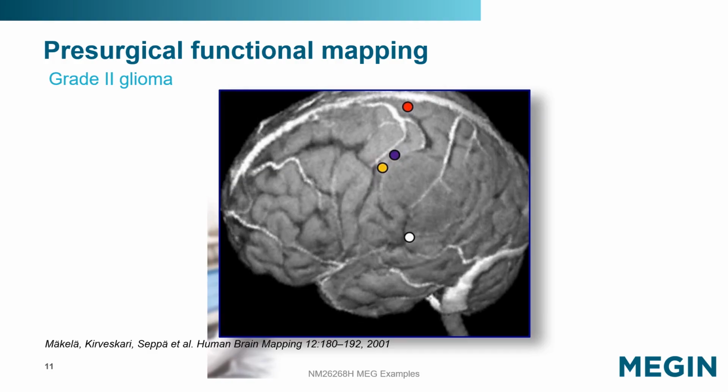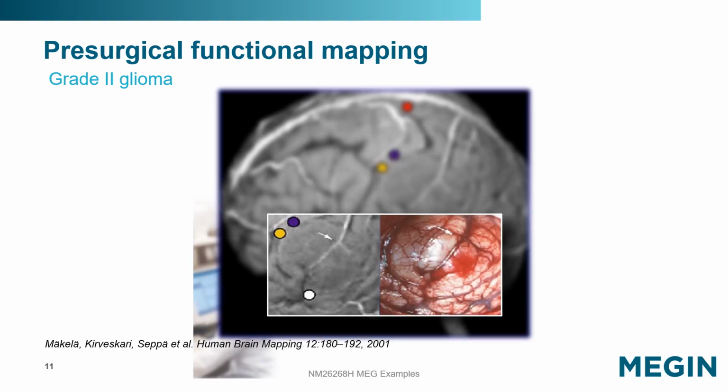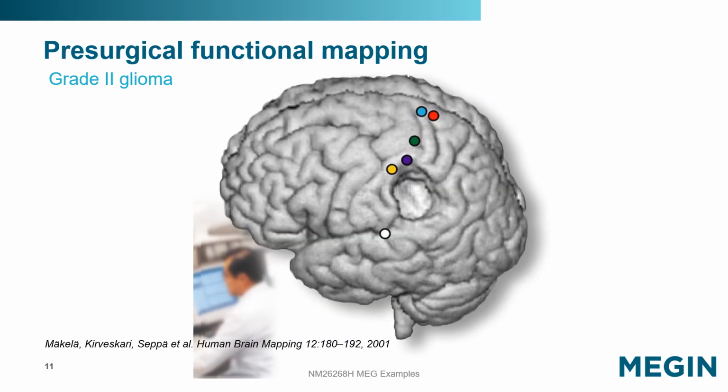The corresponding brain surface image during the surgery indicates that the veins are readily identifiable and allow both the localization of the somatosensory cortex left and the tumor area right below. Vein bifurcation over the tumor is marked with an arrow. The same study was performed after the surgery, and corresponding source localizations displayed on a postoperative 3D rendering surface along with blue, foot MEFs from M1, and green, hand MEFs from M1 indicate that the surgery did successfully avoid any damage to the somatosensory cortex.